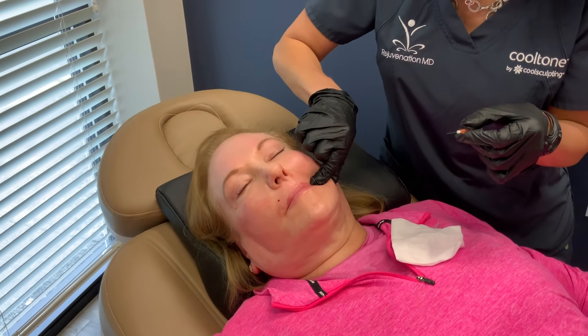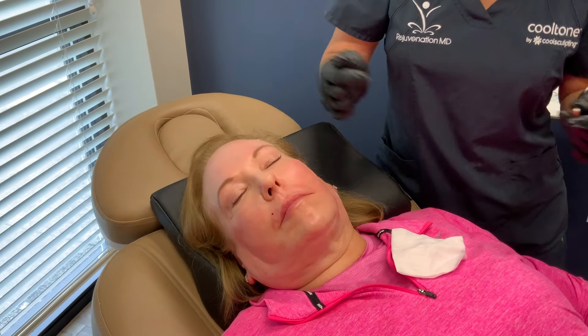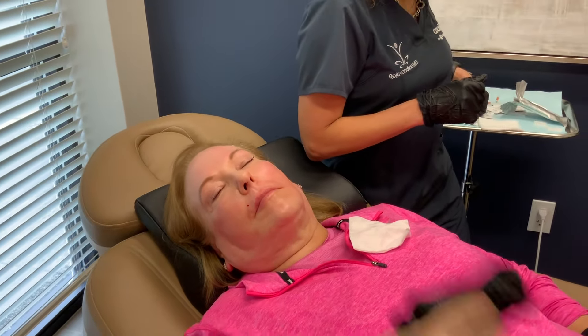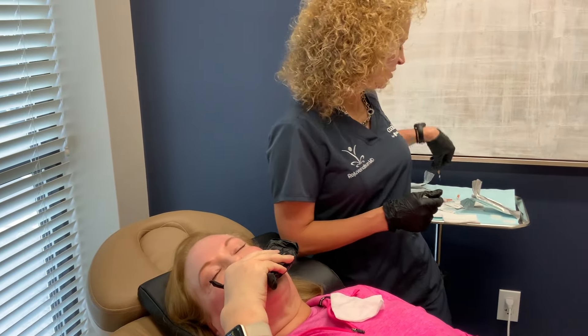If our patient wanted more lip fullness and she didn't want to do filler, we could do some of the twisted ones in her lips to give her more volume there.